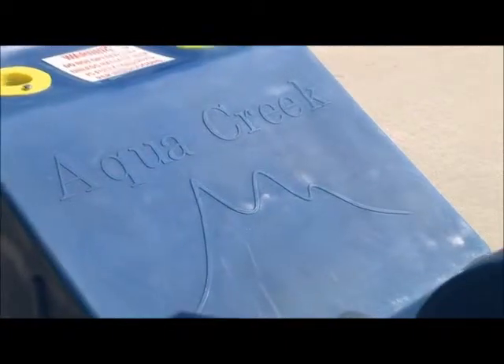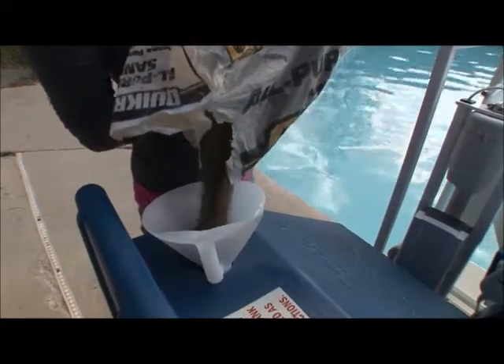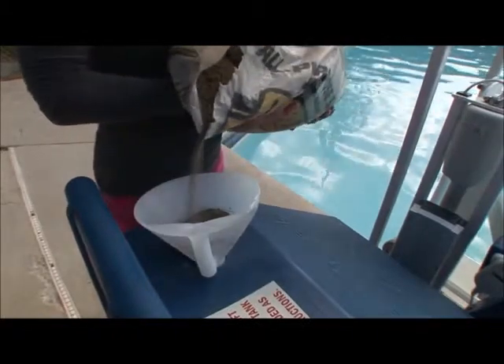The Patriot now gives you the option to choose your type of counterweight — have it shipped complete with weight plates, or save on freight costs by ordering the ballast system where you can use your own sand.